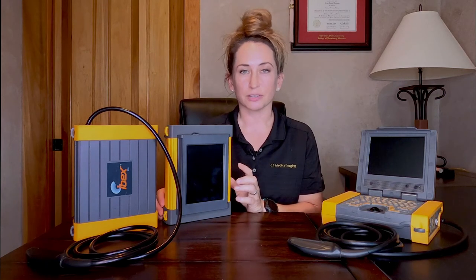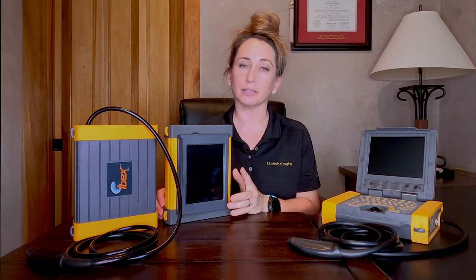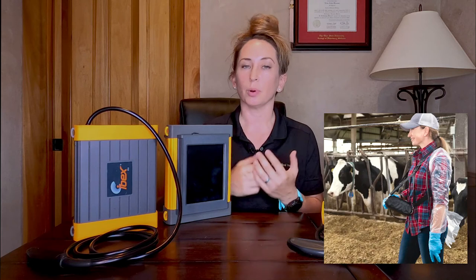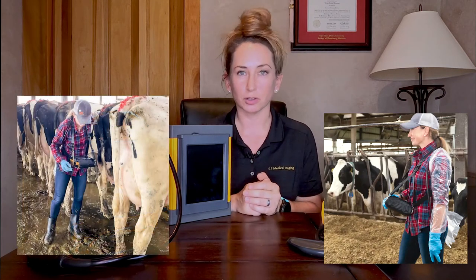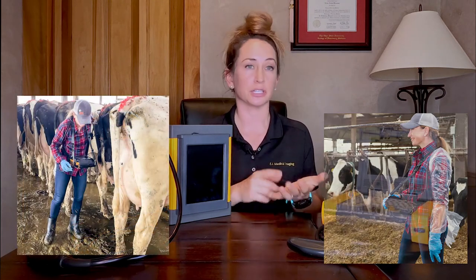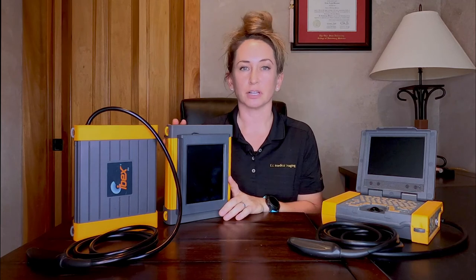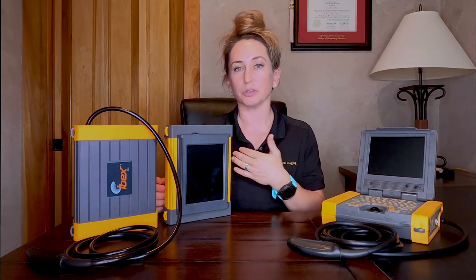The HR is a fantastic choice for anybody who would typically use a Lite system and doesn't need as much access to keyboard applications, but perhaps doesn't prefer goggles or is working in a scenario such as with young mares where they don't want to have something in front of their eyes. It's a very nice alternative and adds the versatility of having the option to use the goggles or not use the goggles for different applications.